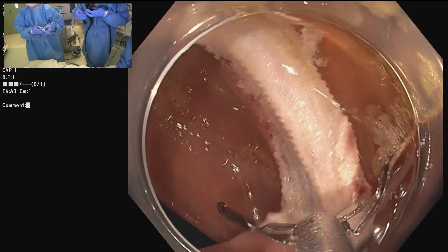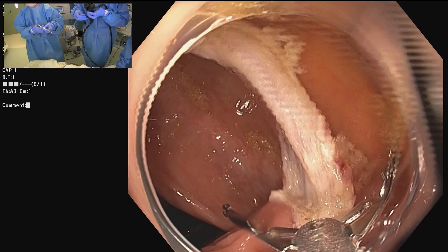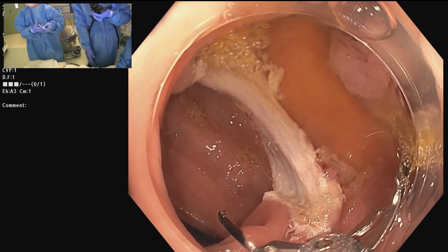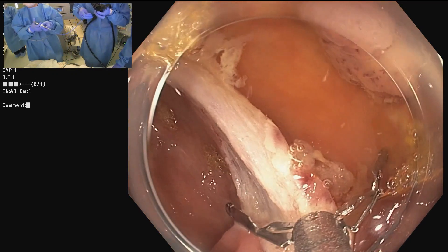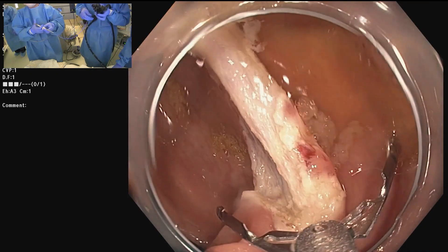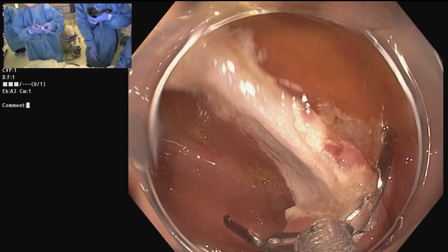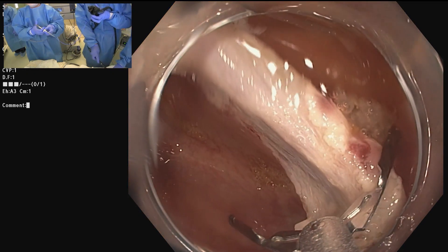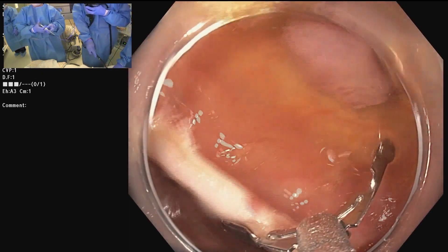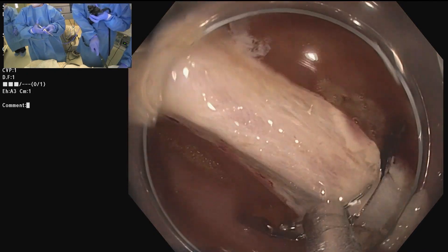I do close all my lesions now, and that is since this amazing 22-millimeter clip became available. Our clips have gotten longer and the prongs have gotten longer, allowing us to close larger defects. What I don't like is when you have that bridge in the middle — I really prefer mucosa-to-mucosa apposition. That would be ideal with a suturing device: throw one stitch and pull it over to close.